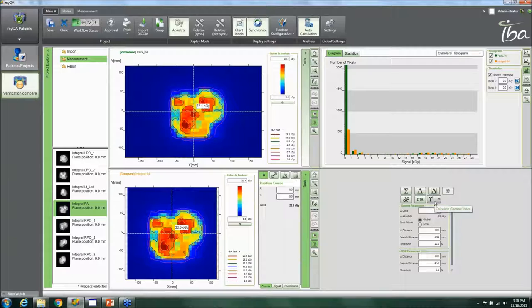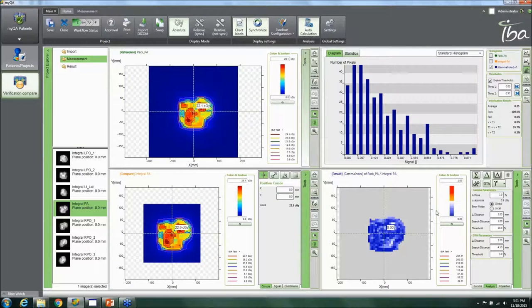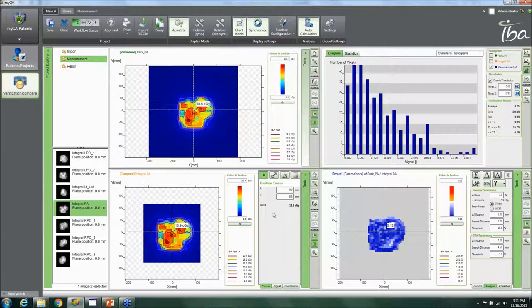You can then click on gamma index or DTA. For example, with a 3% / 3mm criterion, you set your dose threshold to 10%, 5%, 20% — whatever you want — and just click to calculate. You instantly get a nice comparison with verification results showing the passing rate and a histogram. You can move the cursor around to look at different dose points inside the map, including the dose at central axis.